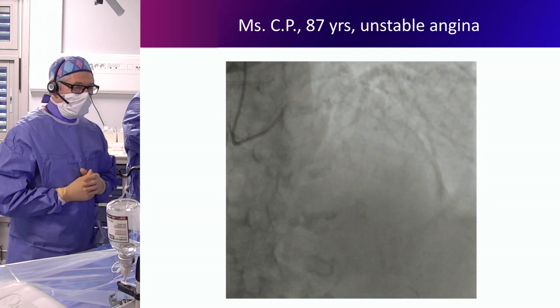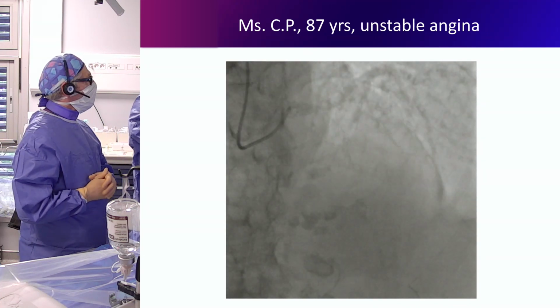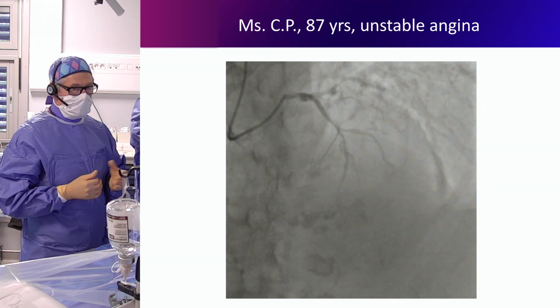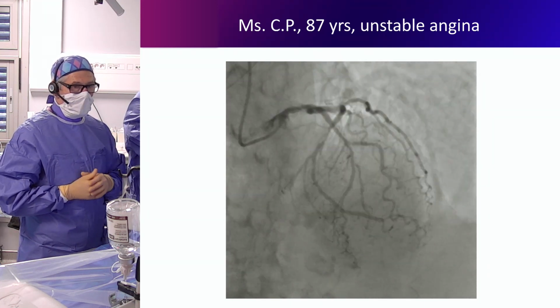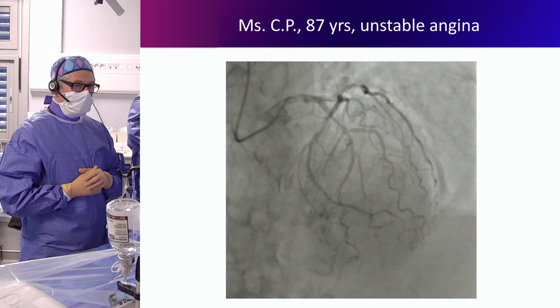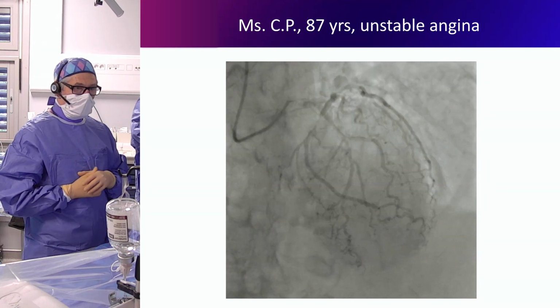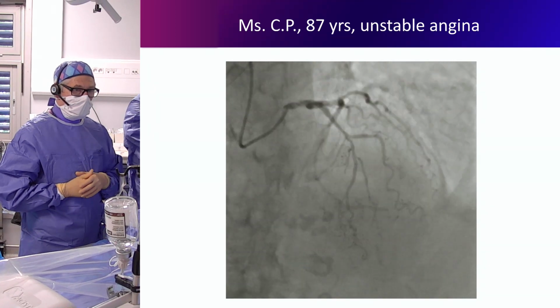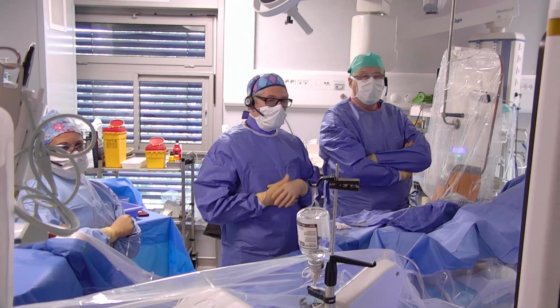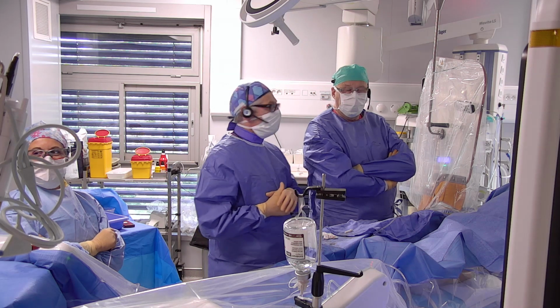I have to say that 3 days before today, the patient was readmitted for angina. It was not unstable, but she had residual angina, which was related to the LAD diagonal bifurcation. And we were discussing with Bernard if we have to do ischemic testing in the LAD diagonal, but now we are convinced that this lesion is really critical with this residual angina. And we have also negative T waves in anterior. Yeah, so the EKG today is a little bit different with more modification in the LAD territory.